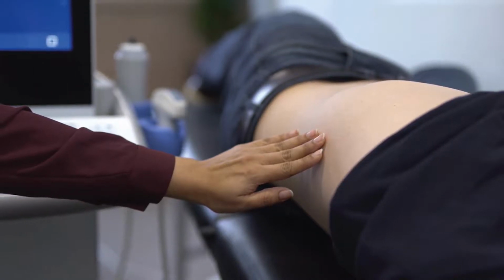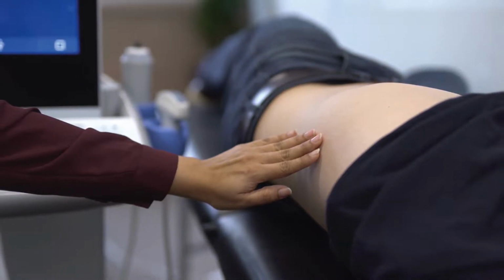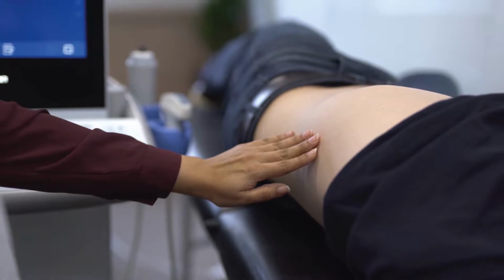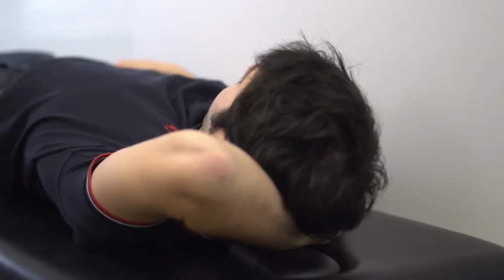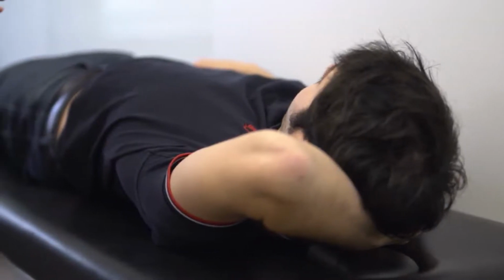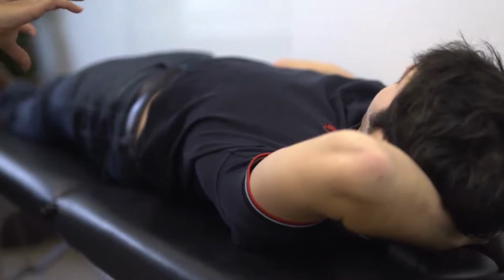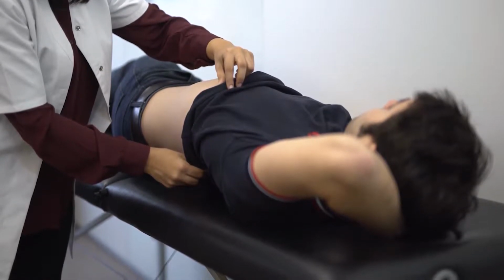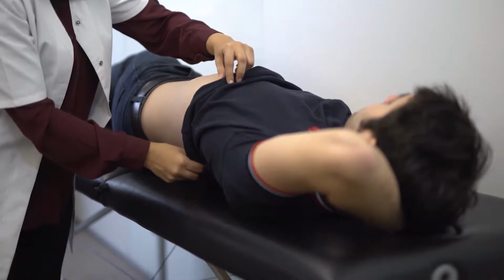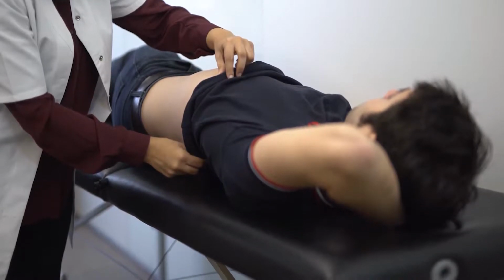To scan the spleen of a patient, the patient should lie down on their back, keeping the left side of the body towards the operator. The left arm of the patient should be underneath the head in maximal abduction. The patient should slightly rotate his body towards the right side, meaning in a slight right lateral position.